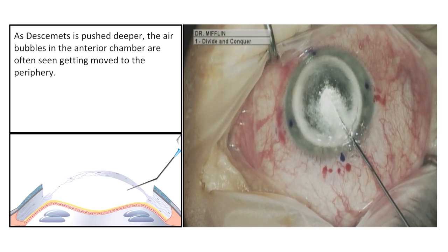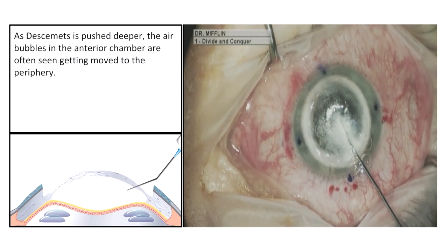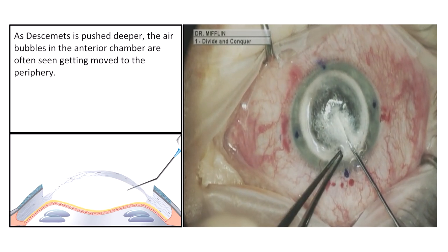As Descemet's is pushed deeper, the air bubbles in the anterior chamber are often seen getting moved to the periphery.